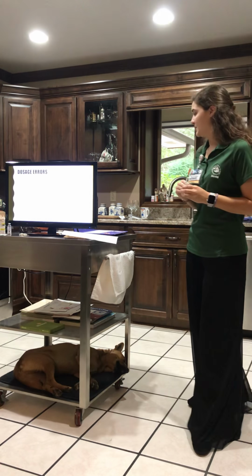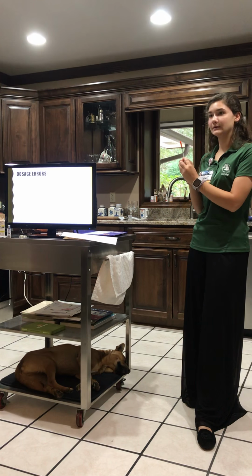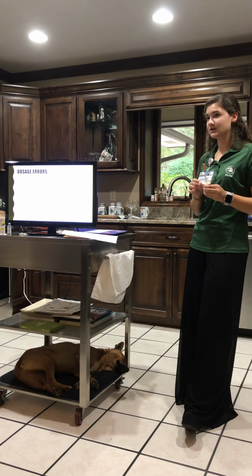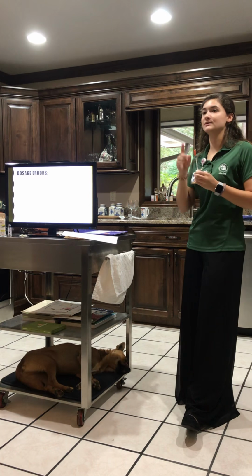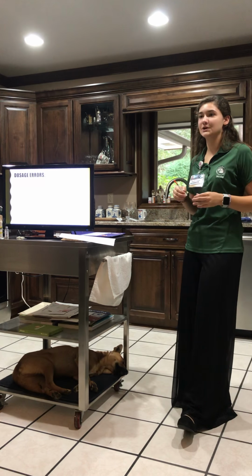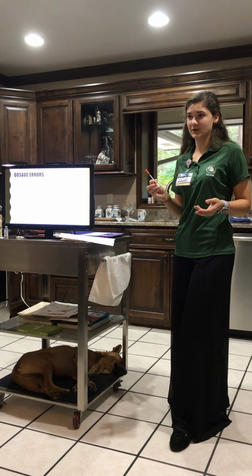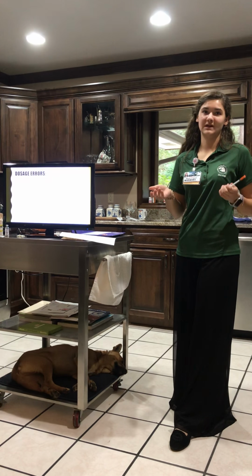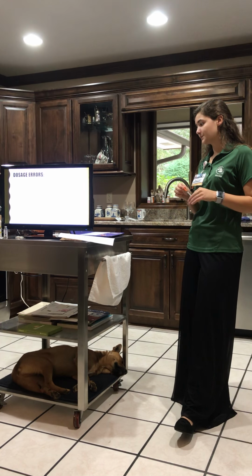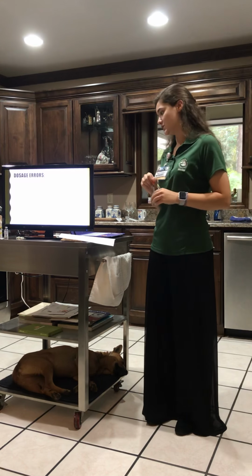And it's very important because a 100 unit syringe denotes 2 units per line on the syringe, and a 40 unit syringe denotes 1 unit per line. So this could be a problem if you are drawing up 40 units with the 100 unit syringe and you didn't calculate your dosage properly, or you couldn't read the doctor's orders properly. So it's always important to know how much you're drawing up with what kind of syringe you're using.